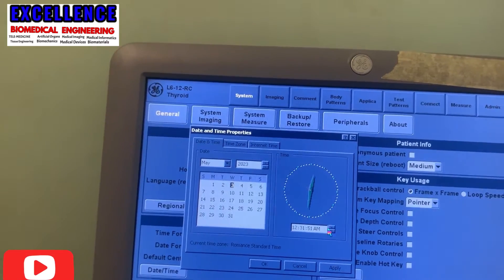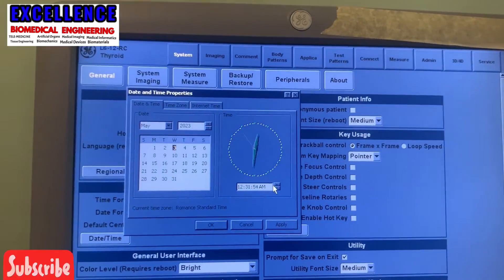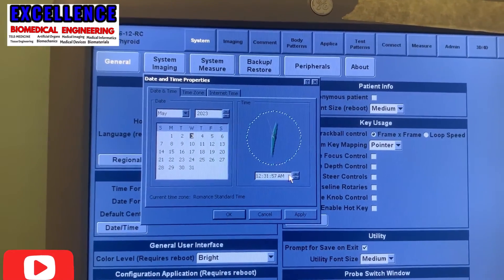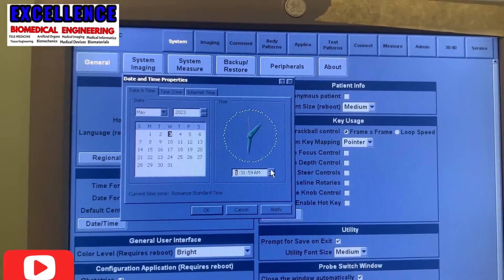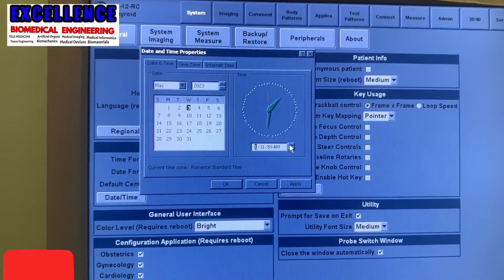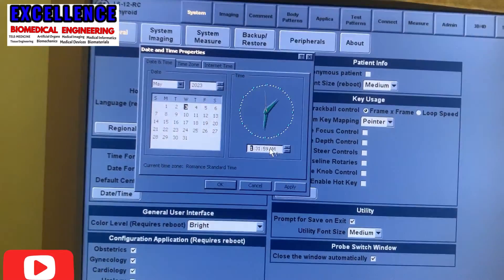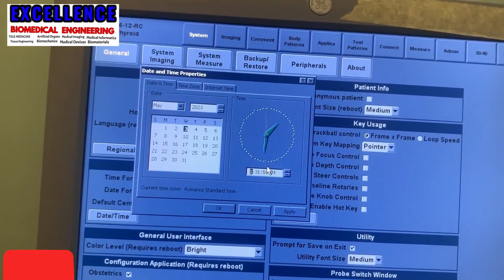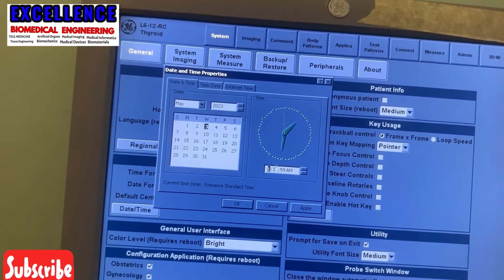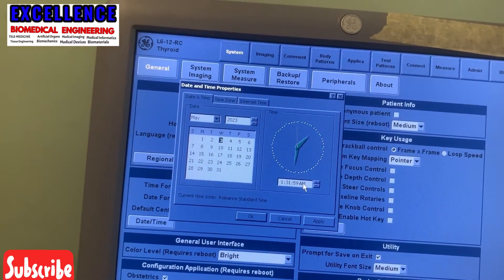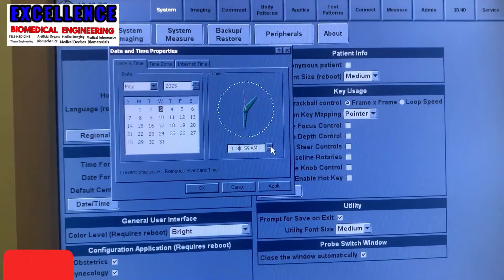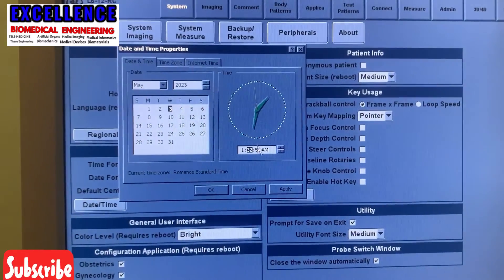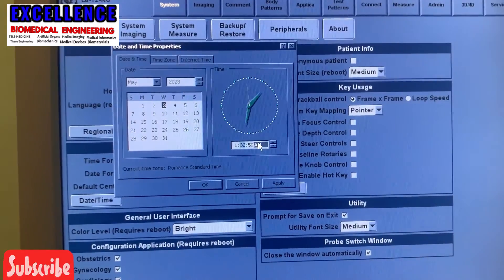Now I'm going to check and set the time. After the time, I'll go to the location — that is the region, the time region. We are in the West African time region, so I'm going to set it to West African time. After setting the time and timezone, I'll apply and then I'm good to go.